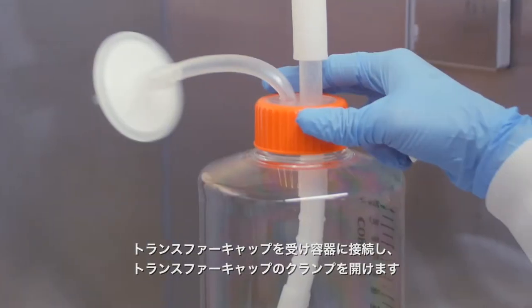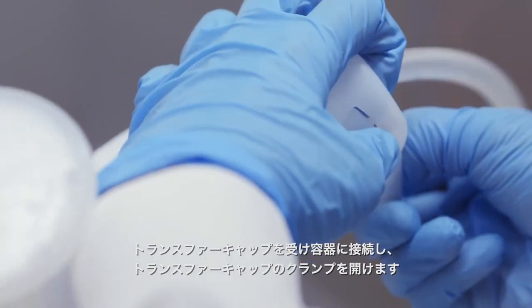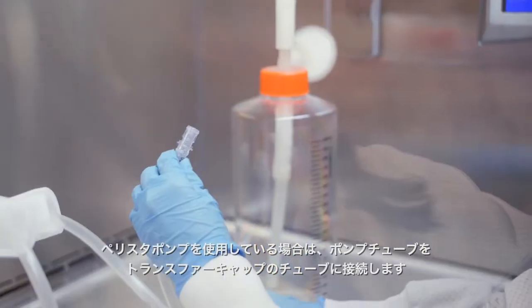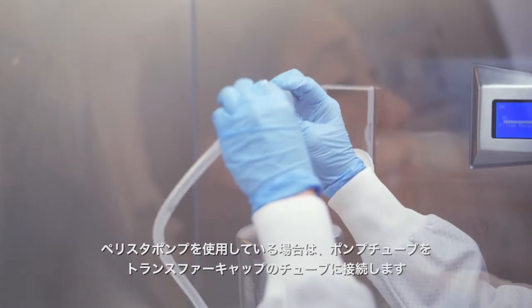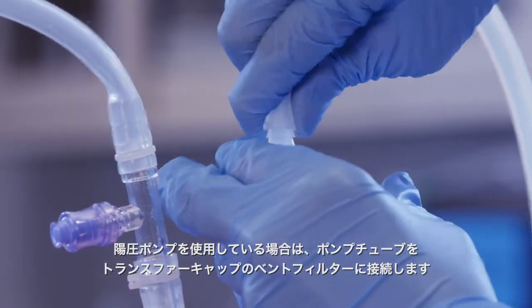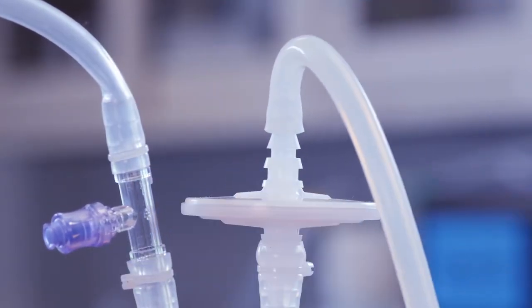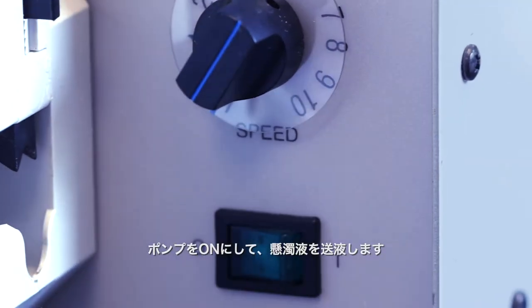Connect the transfer cap to the receiving vessel. Open the clamps on the transfer cap and the receiving vessel. If you are using a peristaltic pump, connect the pump tubing to the tubing on the transfer cap. If you are using a positive pressure pump, connect the pump tubing to the transfer cap vent filter.